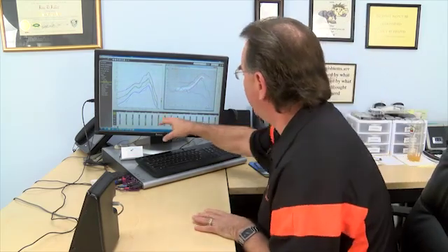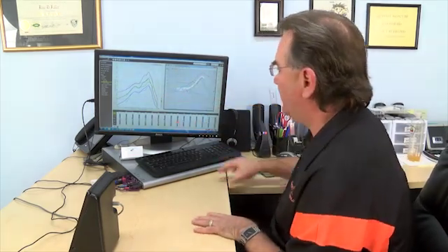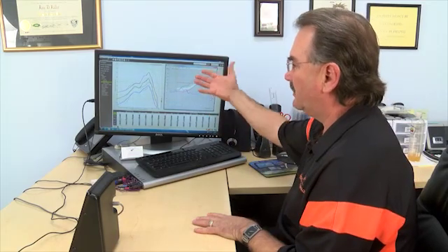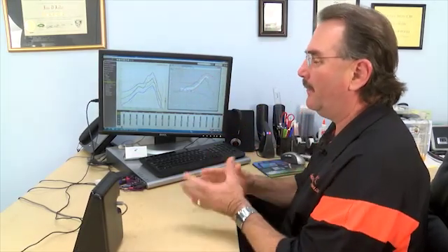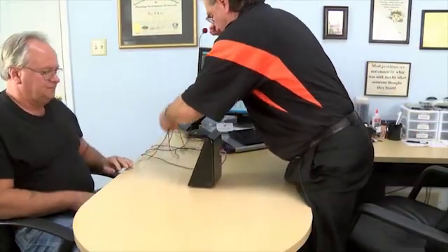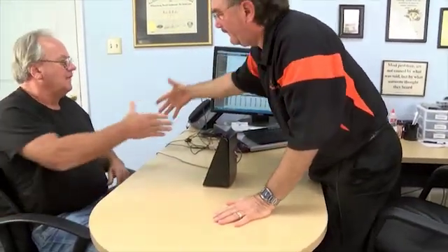So by us programming the hearing aid and using this live speech mapping, I can actually visually see what we want to do to program Tim's hearing aids. And then when we do this and we get it right, once we hit target the way we want, then we can go back and fine tune to the patient's satisfaction on what feels comfortable and sounds to him and how well he's hearing and understanding. And when we get that right, we have a very happy patient.